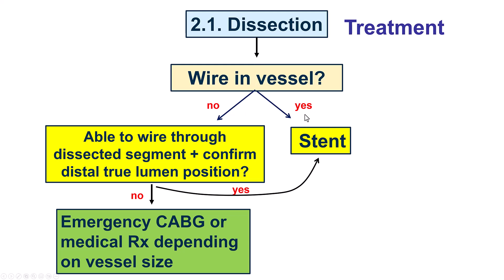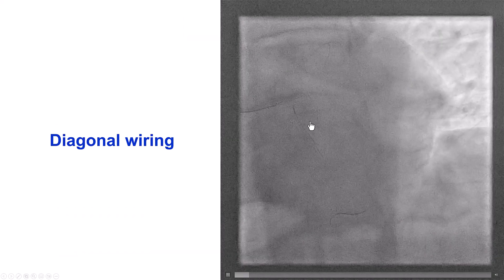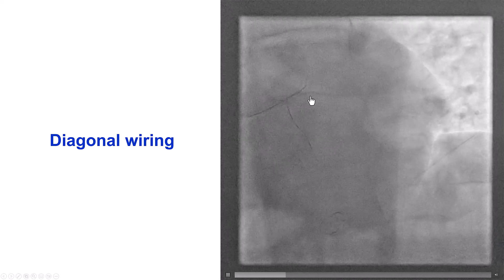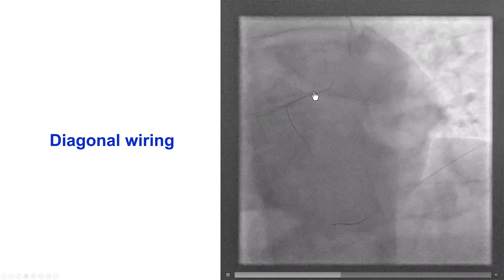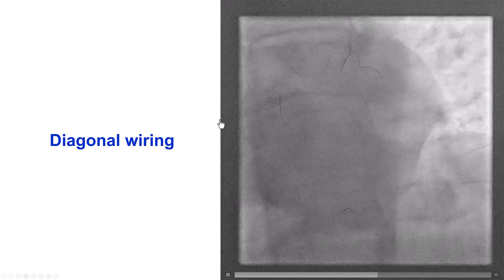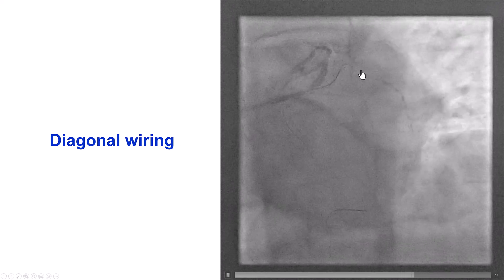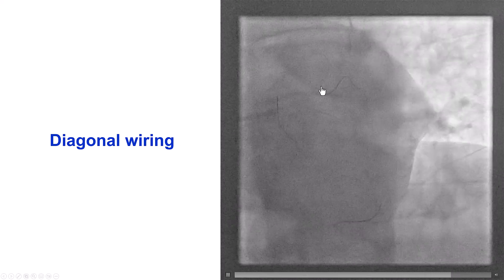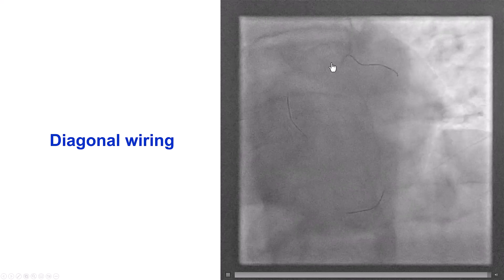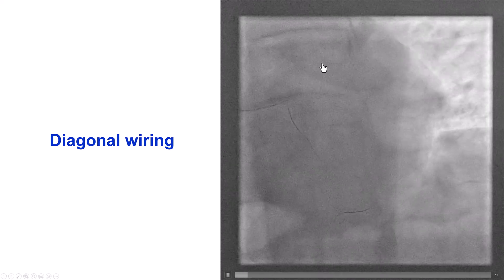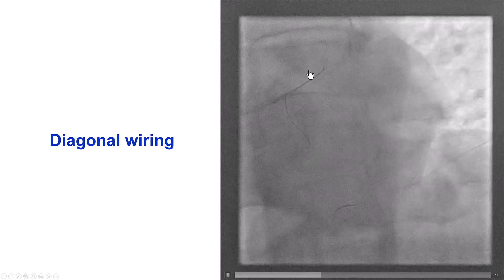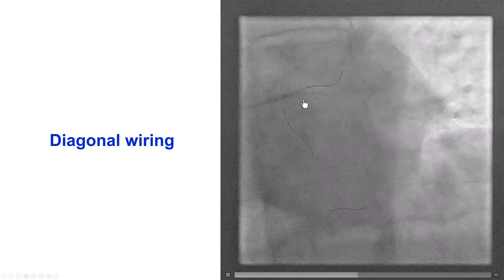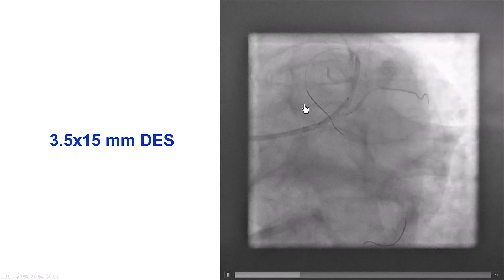We did have a wire in the vessel, and therefore the treatment is to place a stent. However, because the diagonal was within the area of dissection and we didn't want to lose it, we decided to place a wire in the diagonal. Fortunately, we were able to place another workhorse wire into the diagonal branch. There was no loss of blood flow into the LAD, and the patient remained hemodynamically stable despite the proximal LAD dissection.